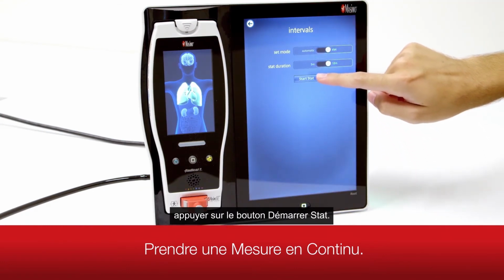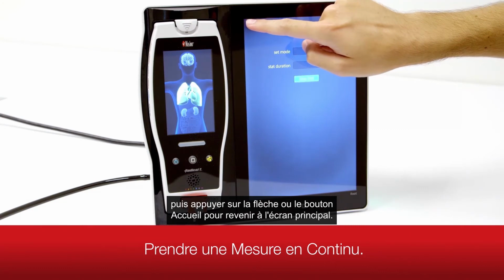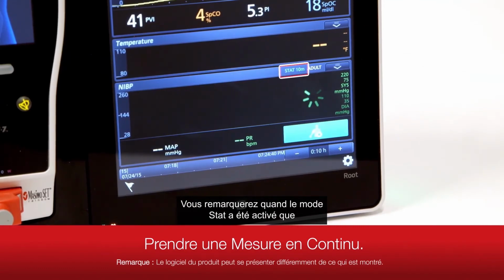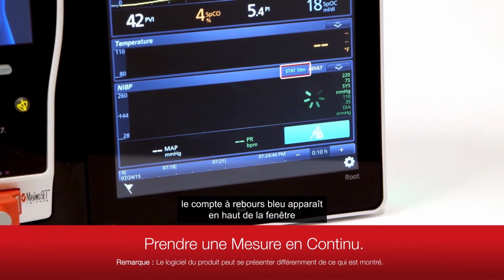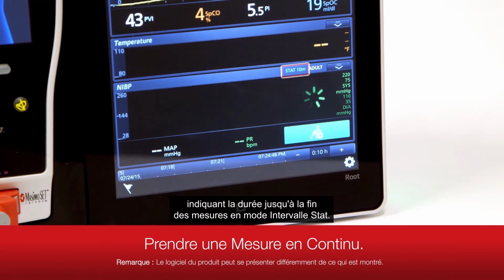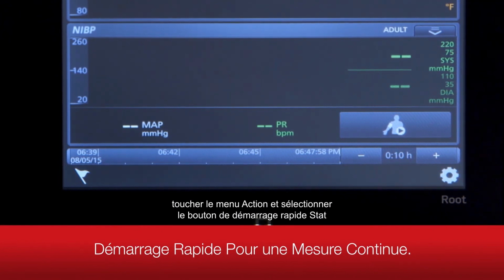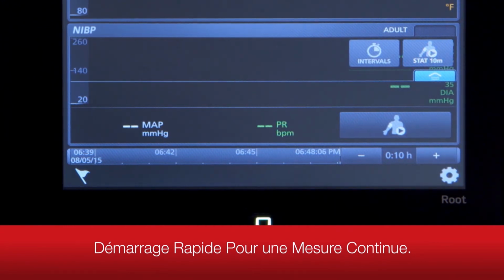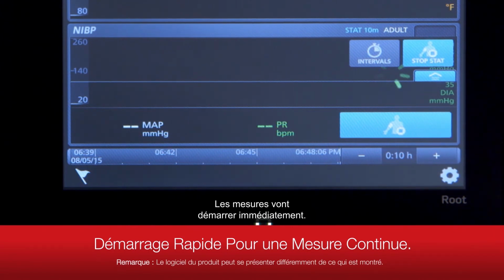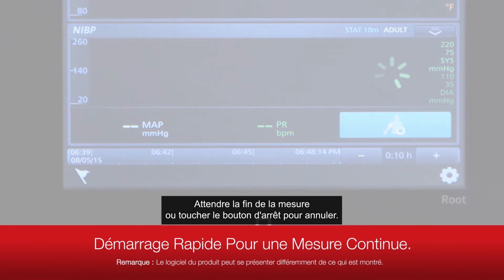To begin measurement, touch the Start Stat button and then press the arrow or Home button to return to the main screen. You will notice when the stat interval mode has been activated, the blue countdown appears at the top of the window, indicating the duration until the stat interval measurements are completed. To quickly enable the stat interval measurement using the previously defined settings, touch the Action menu and select the Interval Quick Start button. Measurements will immediately commence. Wait for the measurement to complete or touch the Stop button to abort.